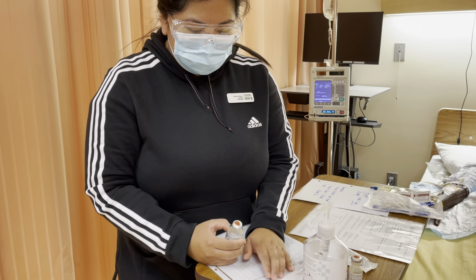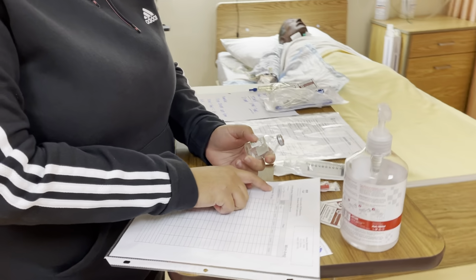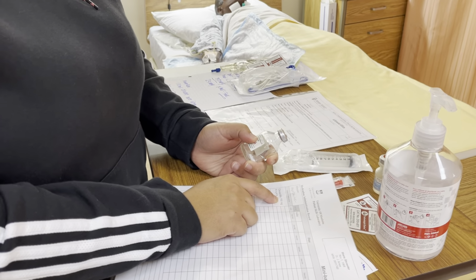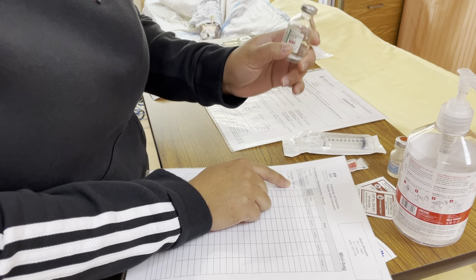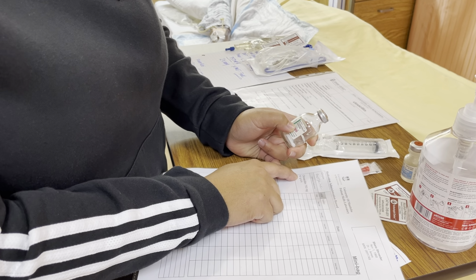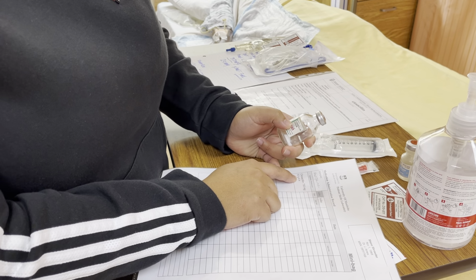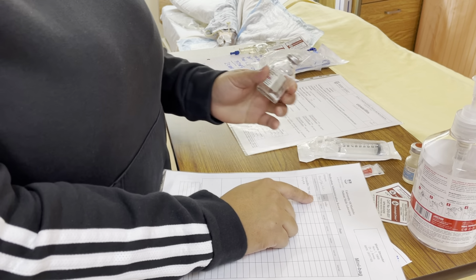This medication is for my patient Sheen Shredder, and the medication's name is Cloxacillin. The dose is 750 milligrams. I have two gram vials, so I can obtain my dose from this vial. And then the route is IV, it says here for injection, and the frequency is every 4 hours. And then it's due now, today.